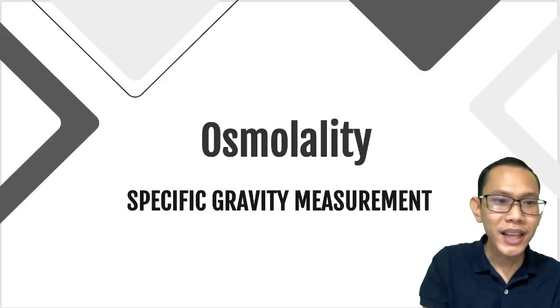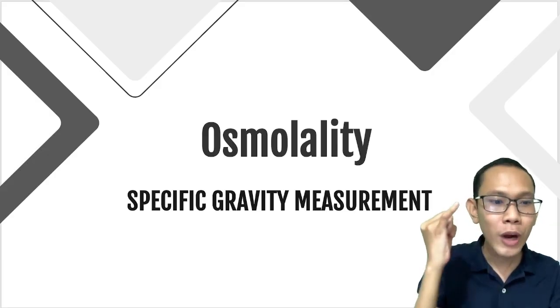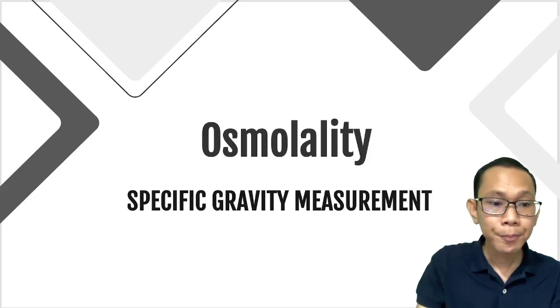So again, tapos na tayo. Madali lang yung harmonic oscillation, based lang sa frequency of your sound wave. Yung urinometer natin based on the density. Yung harmonic oscillation based naman sa ating frequency of your sound waves.